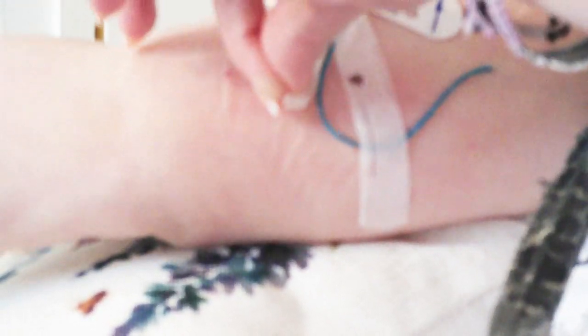So I also use this skin protector, because my skin is just so sore. It's so sore. It gets so sore from all this tape on it all the time.